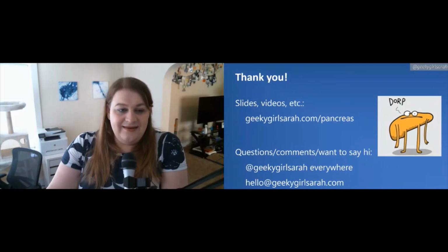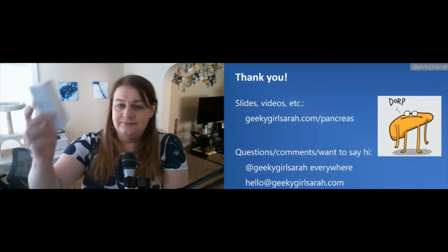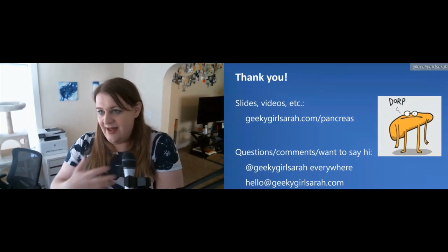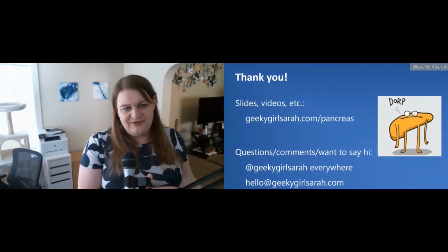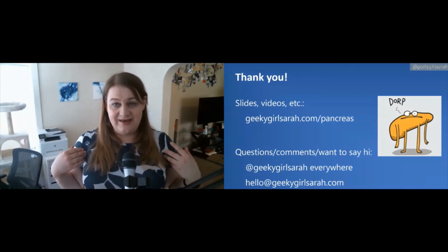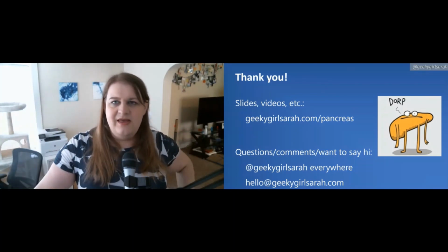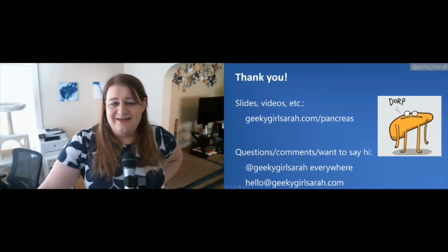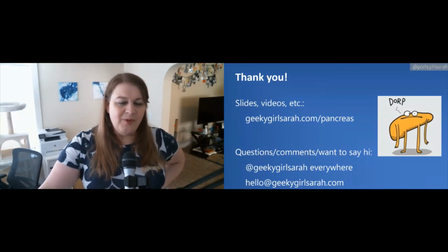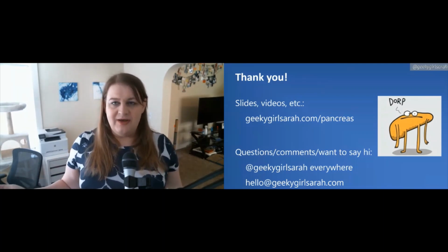And then there's the data and the algorithms. The Dexcom, the Bluetooth sensor and everything, they have their own proprietary app, with all their stuff stored in their systems. So that's why Nightscout is valuable, because I get to keep my data. I can share it with the people I want. I can give you the link to my pancreas and you can see it online. But more importantly, I get to decide what happens with my blood sugar values.